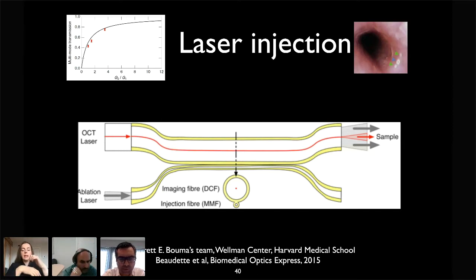And if you look at the laser interaction with skin, think of the egg. When you put an egg in the pan, first it heats, then you have coagulation, right? Your egg white turns white. It was transparent and it coagulates and turns white. And eventually, if you leave it there too much, you get all the vapor out. So you have vaporization. And if you do it very quickly, you have carbonization. It turns black. So you have all these steps and we're trying to gauge this.